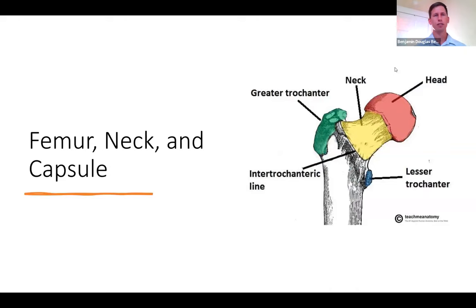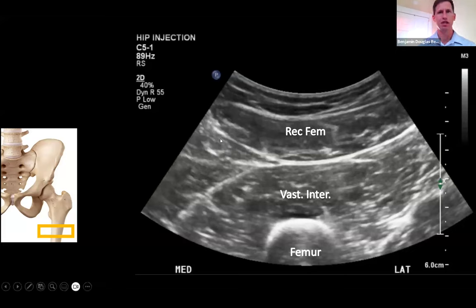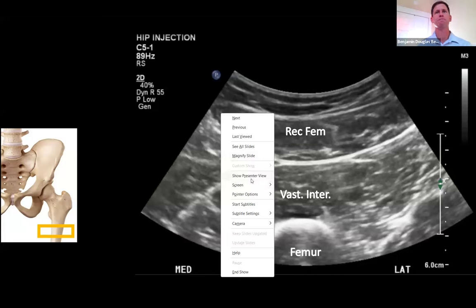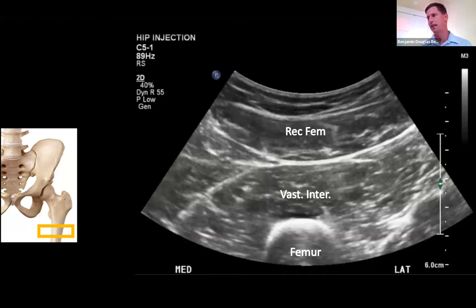The first structures we're going to look at are the femur, the neck, and the capsule. I start my scan in the proximal thigh, place down the probe, and spend some time adjusting gain, depth, and focus. Then I begin to scan cranially, looking for the architecture of the muscles, making sure there are no disruptions, and take a look at the femur to ensure there are no irregularities or masses on the bone itself.